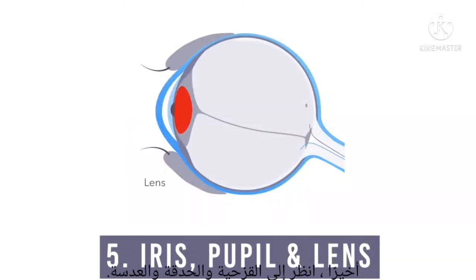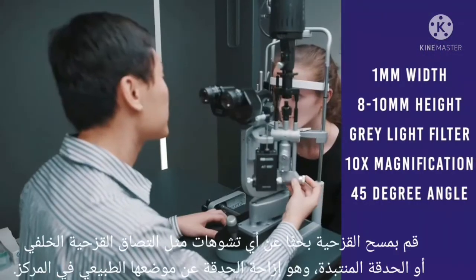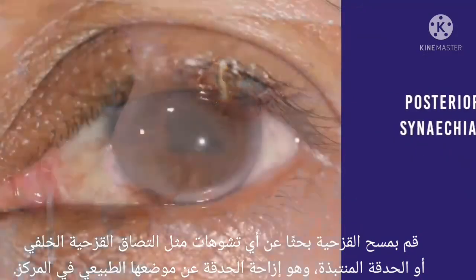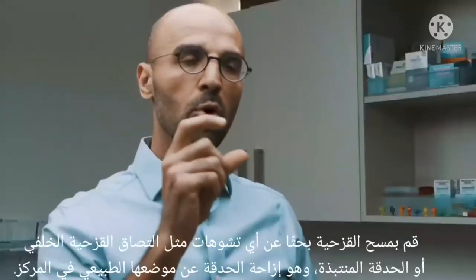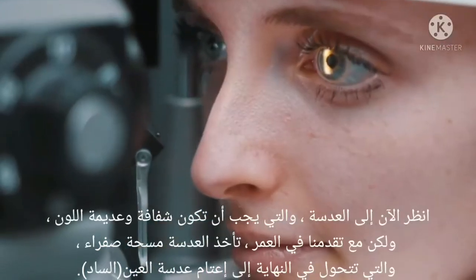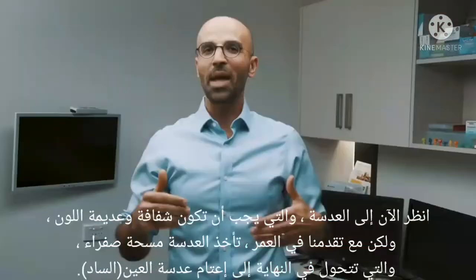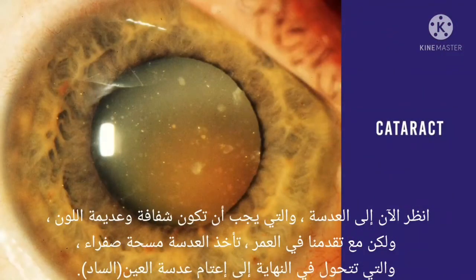Finally, look at the iris, pupil and lens. So return to the same settings as step 3. Scan the iris for abnormalities such as posterior synechia or corectopia, which is a displacement of the pupil from its normal position in the center. Now look at the lens, which should be transparent and colorless, but as we age, the lens takes on a yellowish tinge, which eventually becomes a cataract.